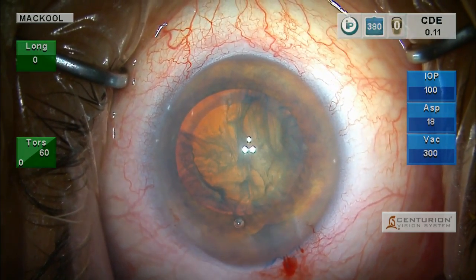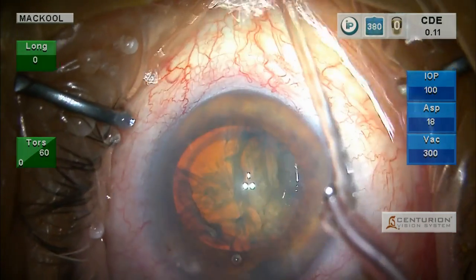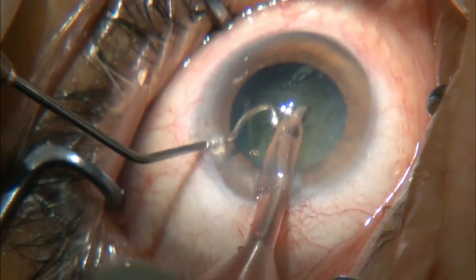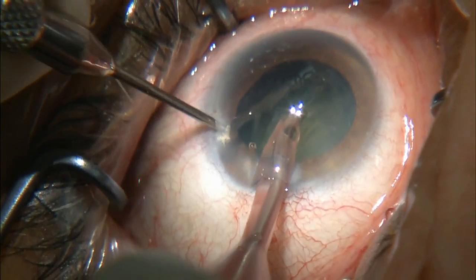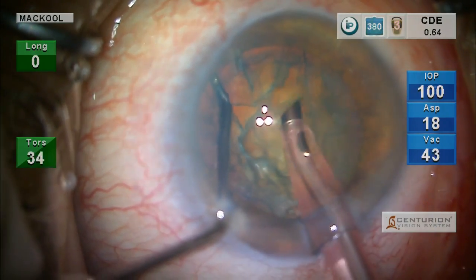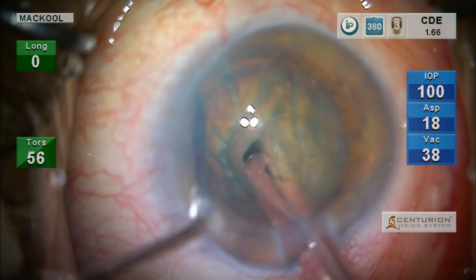Viscoat acts to keep the pupil enlarged simply because it's not easily aspirated. Keeping the nucleus centered is good to avoid zonule stress, and I'm keeping it centered by holding it still with the curved McCool big-ball chopper, which I've inserted out over the equator.